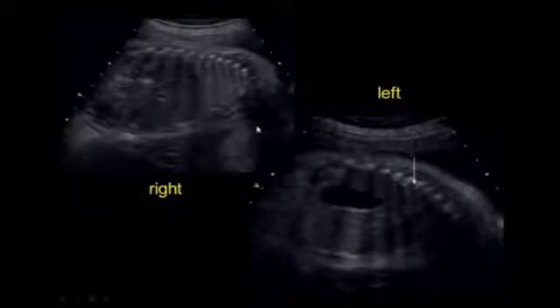Here's a case of a patient who came in, and you can see in the thorax, we see the heart here, and we see a little tiny small lung on one side, tiny small lung on the other side, and this is a bad sign, unexplained severe polyhydramnios. Well, so now we're going to look and see if we can establish what's going on in those chests. And on the right side, we see that the right hemidiaphragm is quite elevated because here are the ribs. You follow the rib cage all the way down to here, and the diaphragm is markedly elevated. Only about half of that thorax is filled with a little small lung on the right.